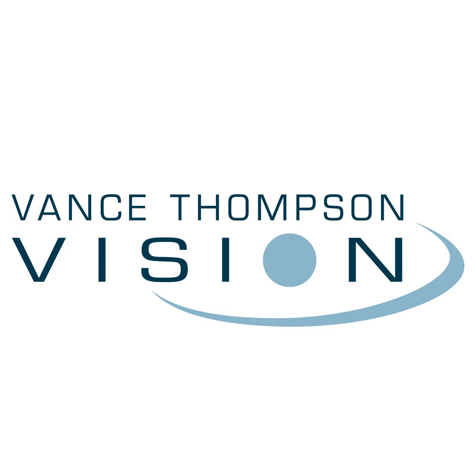We can talk more about some of the other tests that should be standard. Pentacam or some sort of corneal tomography, in my opinion, is standard now. You can't do LASIK without doing tomography. Some of the dry eye testing we're doing is also really important, but epi mapping. I'm going to pause you. Can you differentiate topography and tomography, and why tomography specifically is important?